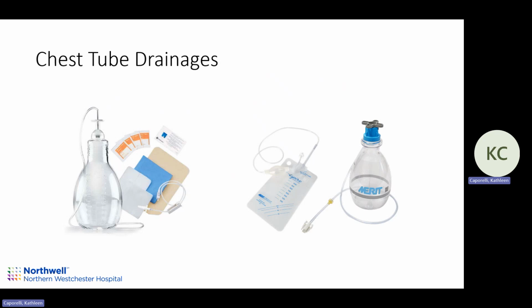And then these are just some of the drainage systems for the various tunneled catheters. I talked about the Pleurex and the Aspira. This is the Pleurex one. So basically, you'll see the little tubing coming out. You hook this part of the tubing into the tip of the Pleurex.